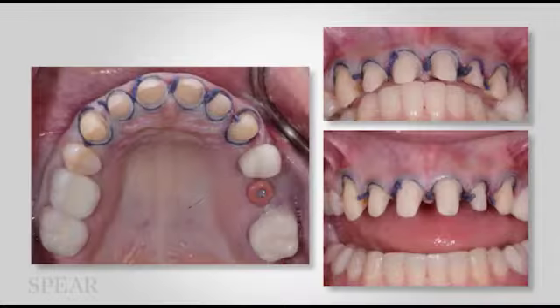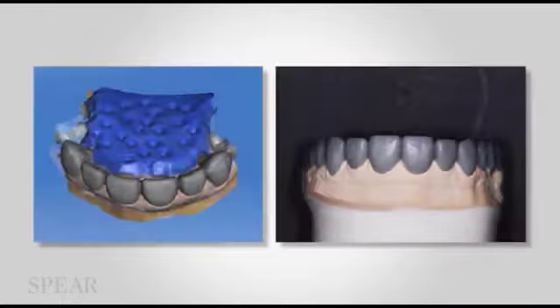The next day I started and I just prepared her upper anteriors, and then I scanned those in. And again, I want to quickly share with you how and why I scanned those in, because we had to use something in digital dentistry. We have to have data points to stitch everything together.